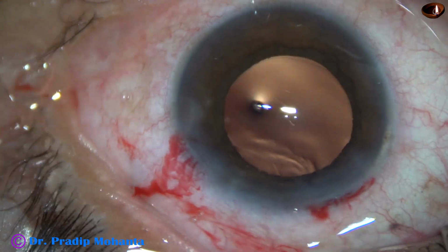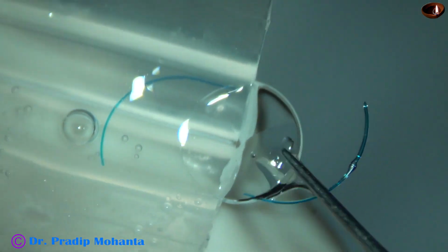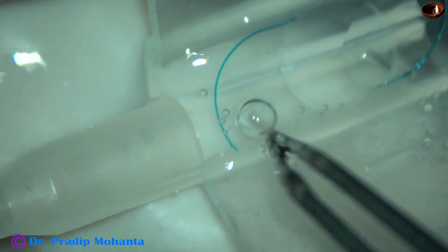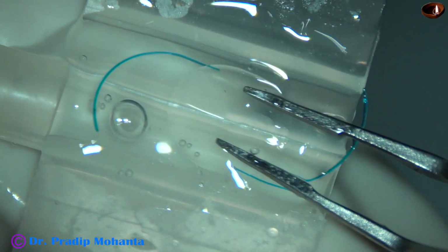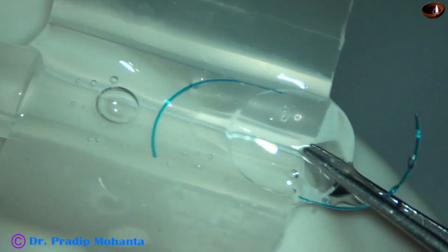Because we are going to use a multipiece intraocular lens, it needs a B cartridge to implant this lens, and it is always better to enlarge the main wound so that the tip of the cartridge goes into the anterior chamber.